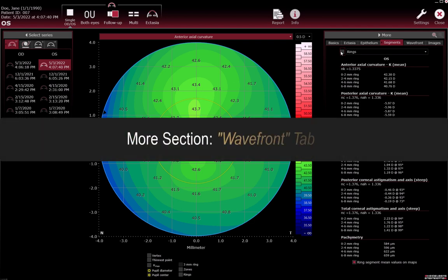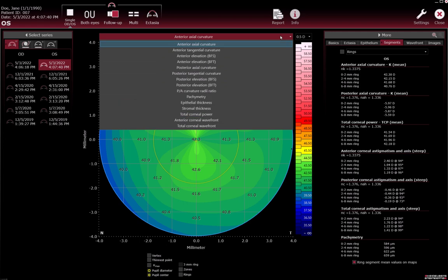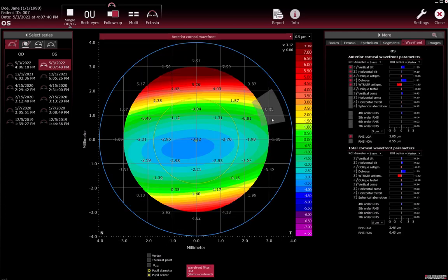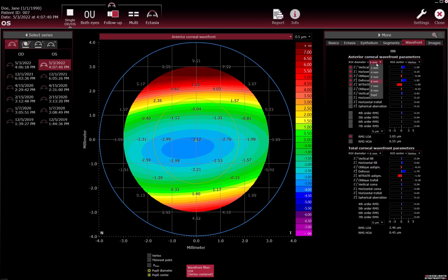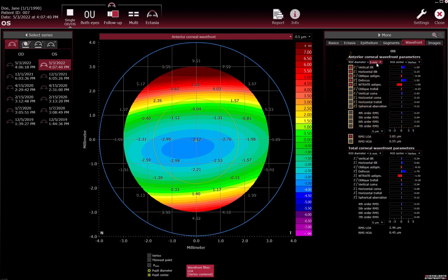More section Wavefront tab. Choosing the wavefront colour map automatically selects the Wavefront tab. Select the diameter and the centre of the region of interest. Various parameters can be considered to create the wavefront colour map. Select or deselect the checkbox next to the wavefront parameter.